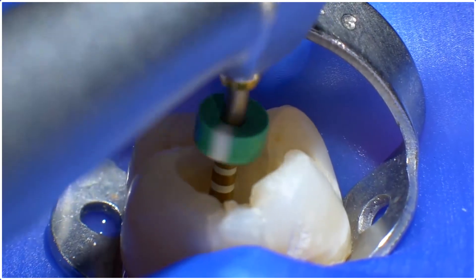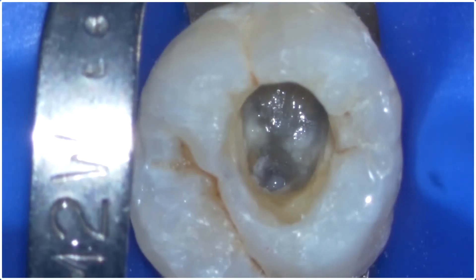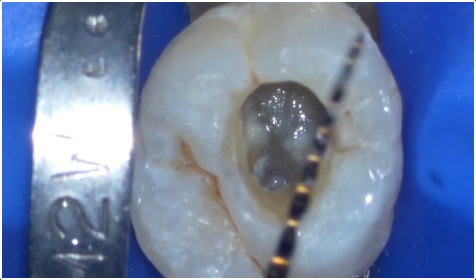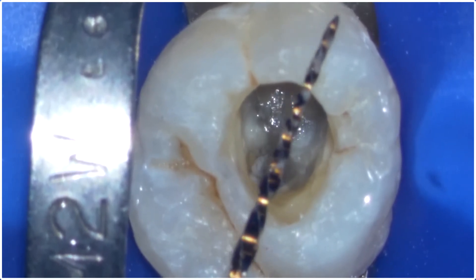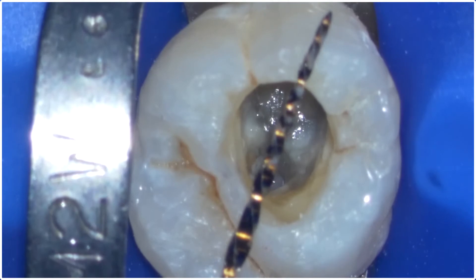Even though the medium has that 35-06 taper, the incredible flexibility of the gold alloy allows it to negotiate almost any curve that the primary did.